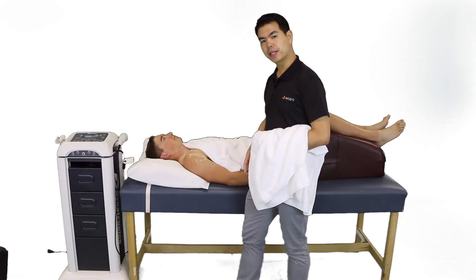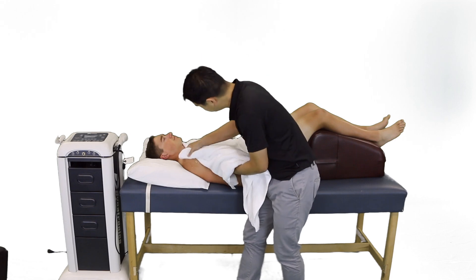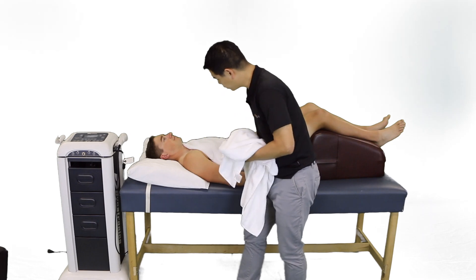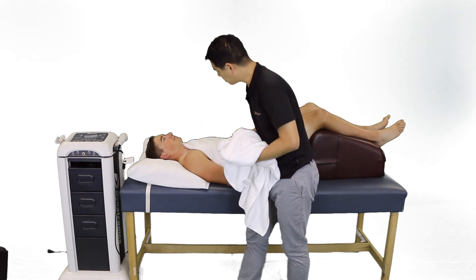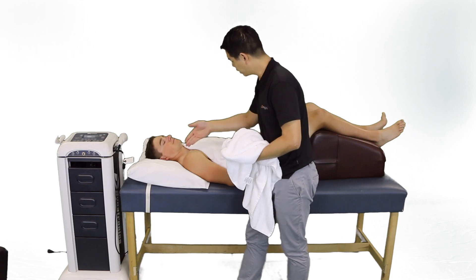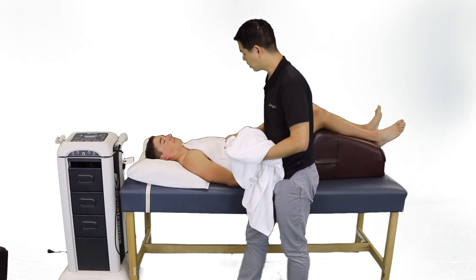After the ultrasound is complete, it's time to clean the patient up, assess the tissue integrity, and ask the patient about their pain and comfort level. "You feeling okay?" "Mm-hmm." "Any changes related to your symptoms?" "It feels better." Okay, good.